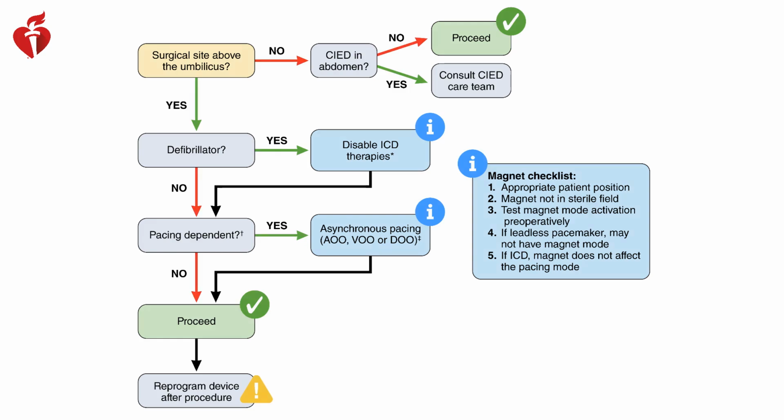The figure that we presented in the first section of the article is really geared towards creating a kind of straightforward workflow for people in the perioperative setting to have the information they need to take good care of the patient. It covers 99% of patients going through care.